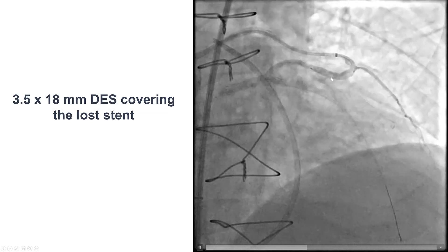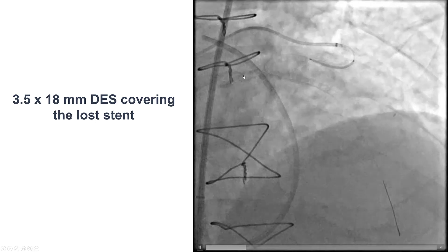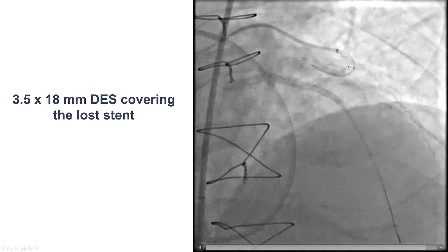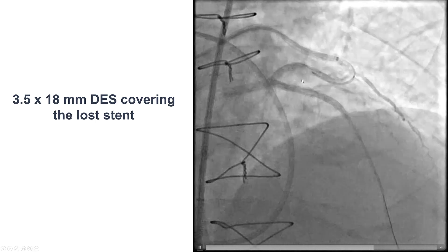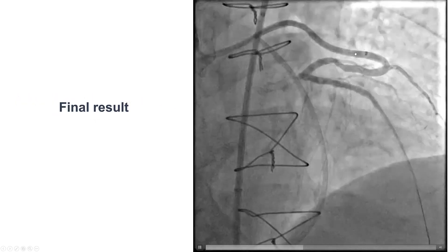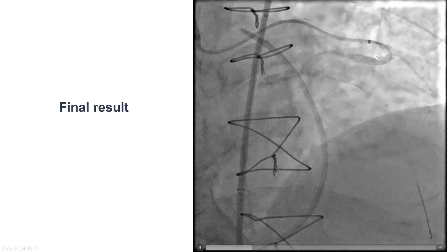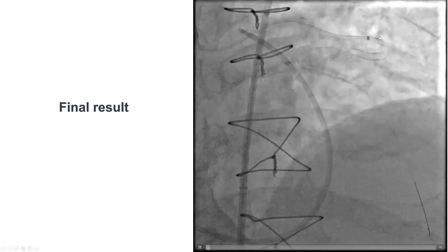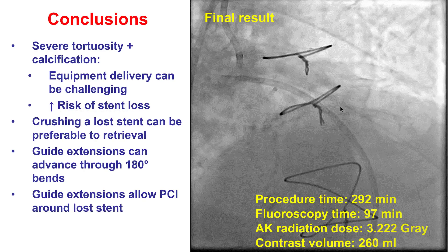At this point, we wanted to make sure that the lost stent would not migrate distally. So we placed a 3.5 by 18 mm drug-eluting stent into the diagonal, essentially covering the previously lost stent. This was the final result — good flow into the graft, no injury on the graft, good flow into the distal segment of the diagonal branch, and good flow into the LAD.